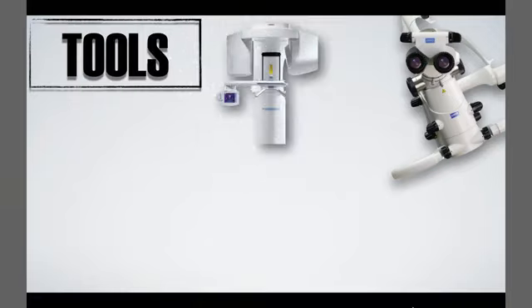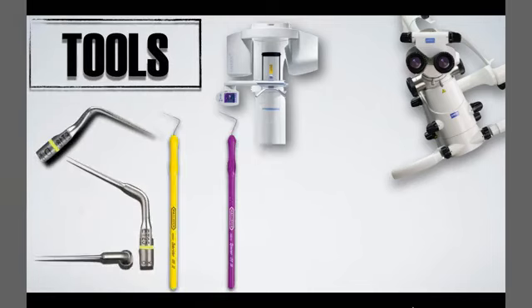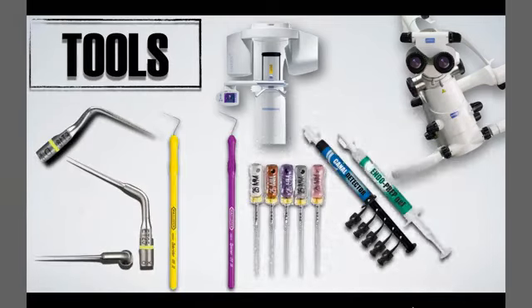Also, an important tool is the 3D cone beam, which guides us to the root canal orifices and gives us much important information about calcification. Also ultrasonic tips, diamond, stainless steel, non-coated and coated tips, micro openers, stiff manual files like C files, for example, canal detectors like methylene blue, and also EDTA gel for glide path management of the manual files.